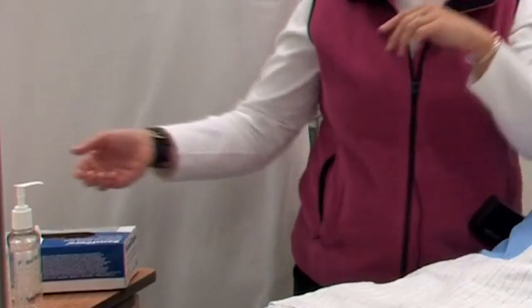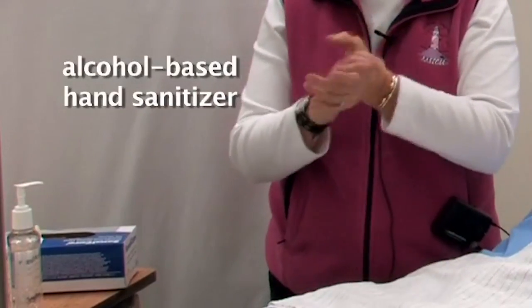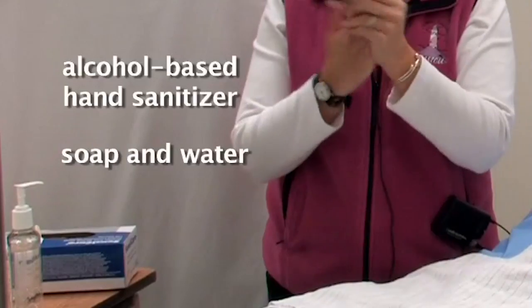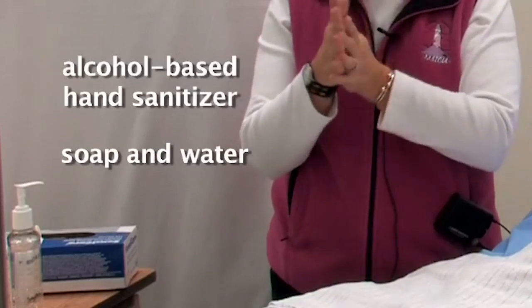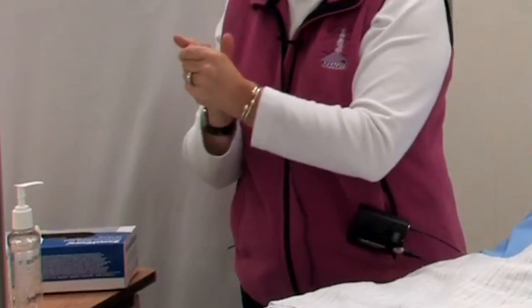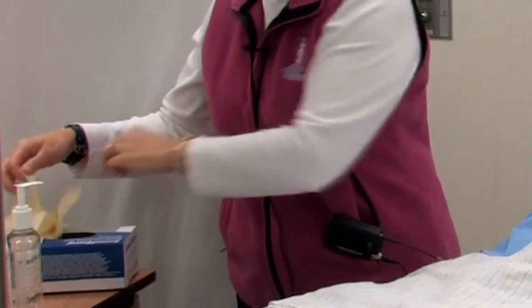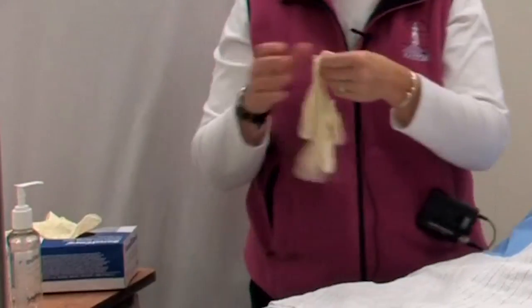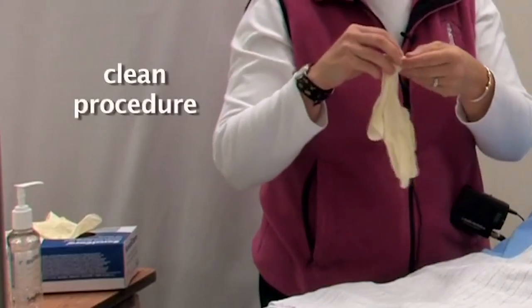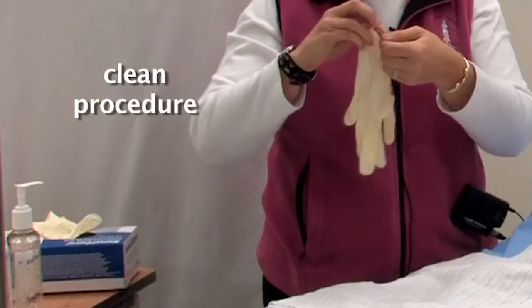I am going to wash my hands with an alcohol-based hand sanitizer, or you can wash with soap and water. Nasopharyngeal suction is generally a clean procedure, but you could use sterile gloves as well.